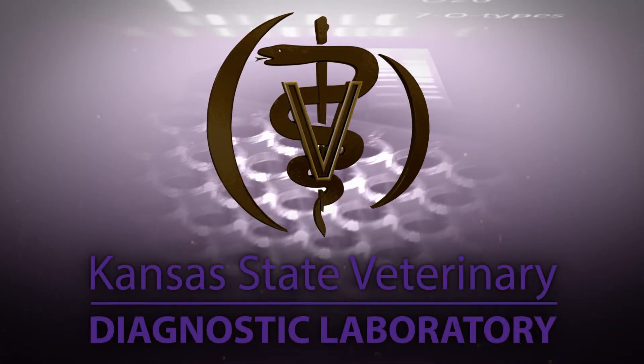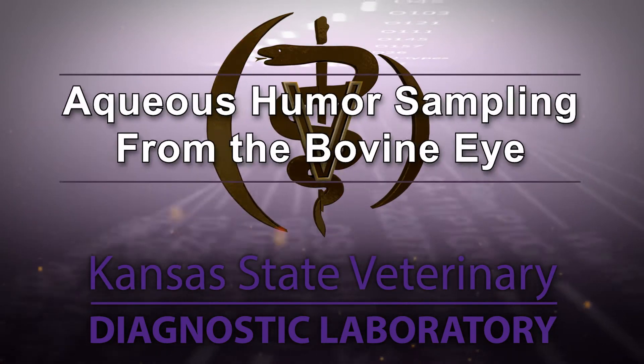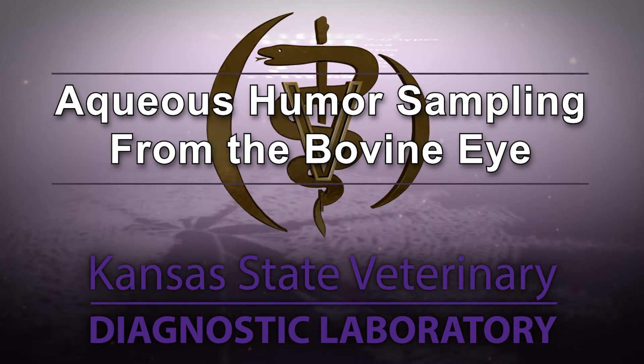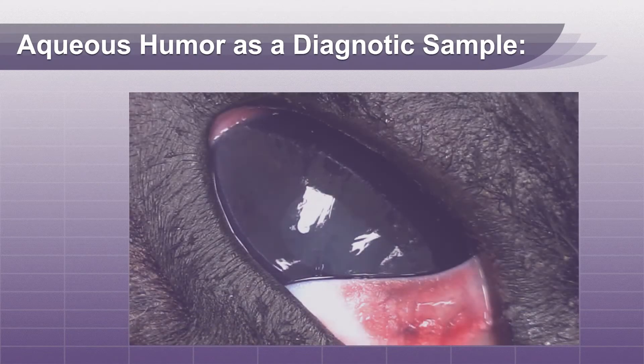Hello and welcome to the Kansas State Veterinary Diagnostic Lab YouTube channel. In this video we will demonstrate a method to sample aqueous humor from the bovine eye. Aqueous humor can be used to diagnose several toxicities or deficiencies in the post-mortem bovine.